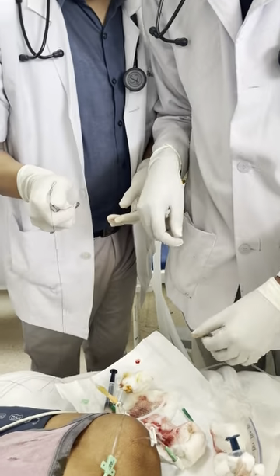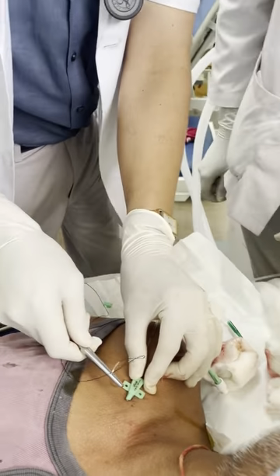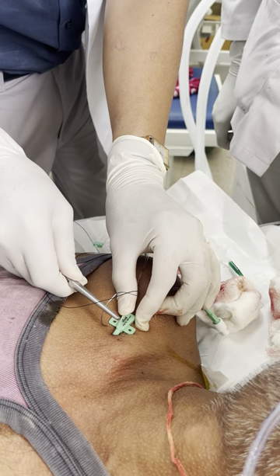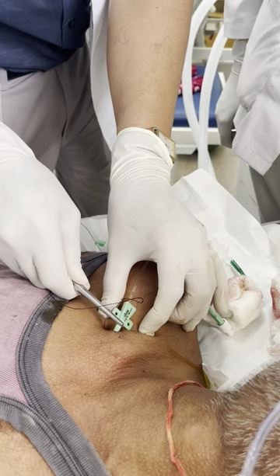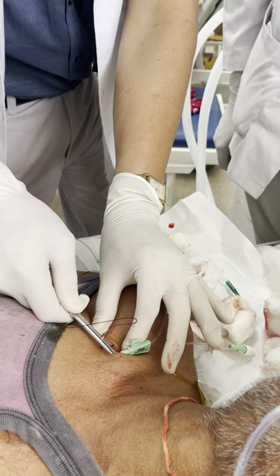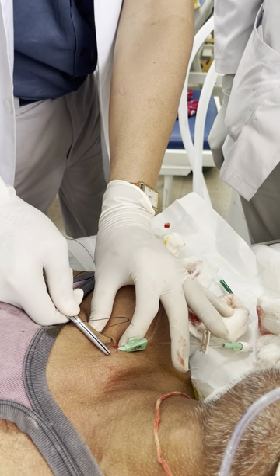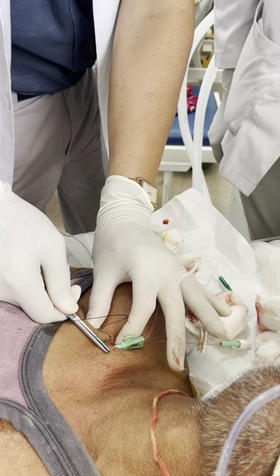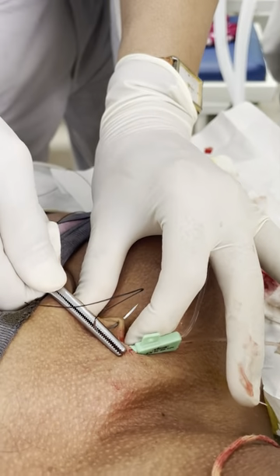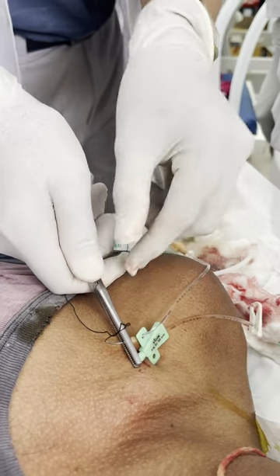Have you ever stitched? Yes, sir. Don't hold it here, you will hold it here. So how will you go? Inside. First, inside. Adjacent to, not exactly beneath the hole, adjacent to the hole, will go skin deep. Okay? If you want to be still better safe, make a fold like this. We are piercing horizontally and the fold is longitudinal. See, so by making a fold we are damn sure that it is piercing skin only, not piercing any underlying tissue.